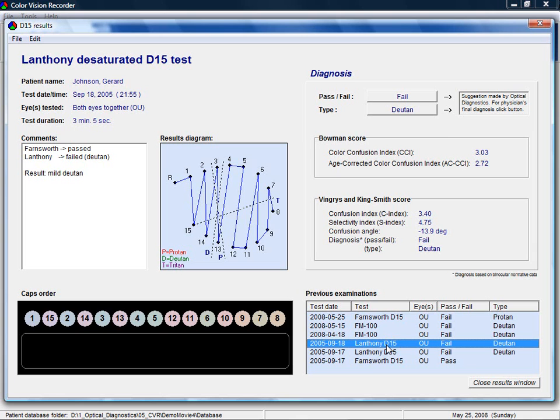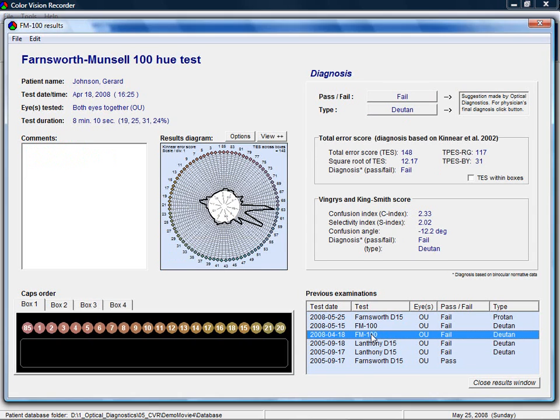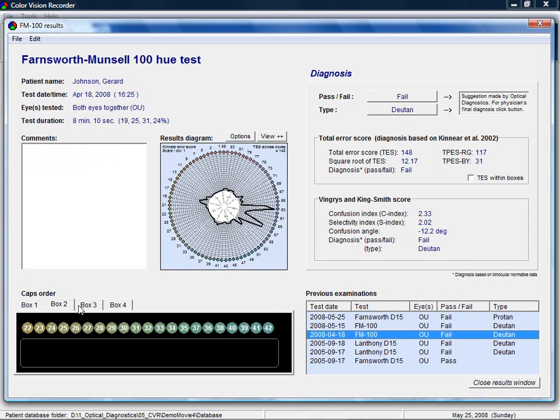A Farnsworth-Munsell 100 Hue test result looks similar to that of the D15 test results. Now there are four boxes with cap orders. The analysis includes total error scores and the diagram is the polar graph of the error scores.